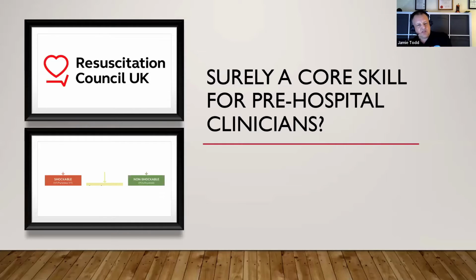So that's been a core of training for quite a long time. Back from when there were only manual defibrillators, then into the very early AEDs, and then a larger use of AEDs for a while, then back to manual defibrillation for a reason we'll discuss in a minute.